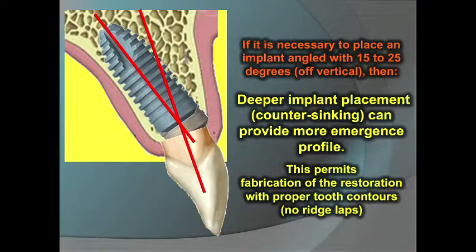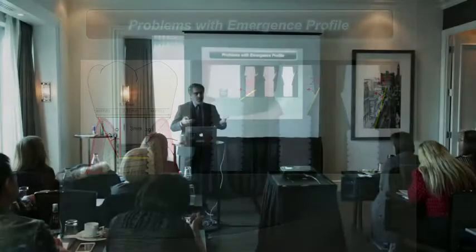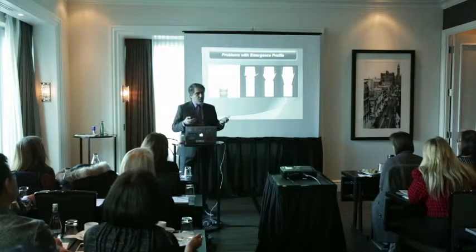an acceptable emergence profile. So when you look at the comparison of different levels of implant, you can see in this picture that with the implant deeper, the technician will have a better option to provide the emergence profile, while here the technician has to form the platform so quickly and bring the transition line from the platform to the level of the abutment so quickly.